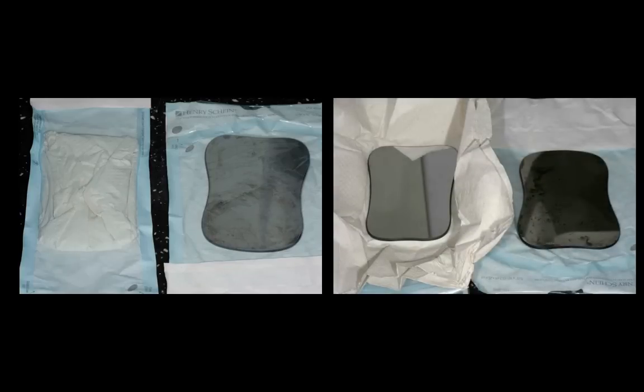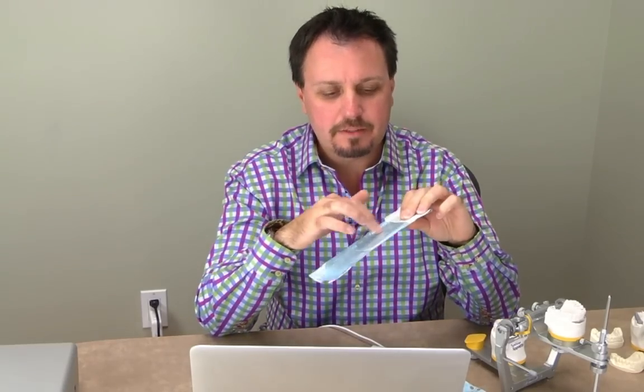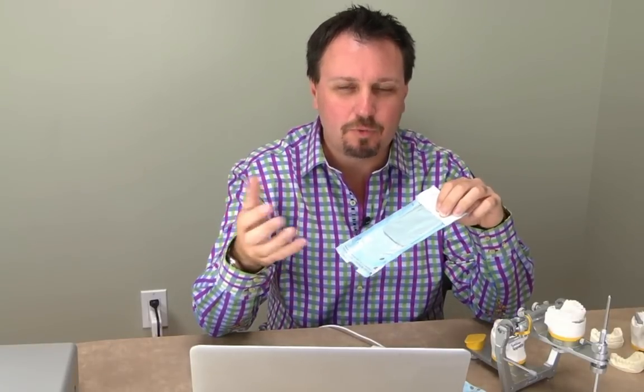I wasn't sure if this would work, but I'll share some photos. We did a little case study — unwrapped and wrapped mirrors put through the autoclave. I took them out, unwrapped the wrapped mirror, unbagged the other — both were bagged after autoclaving. The bagged-and-wrapped mirror is way better than the bagged-alone mirror. The paper towel absorbs all the water after autoclaving, so the surface of the mirror is really clean with no water stains, and it's much more efficient to use.